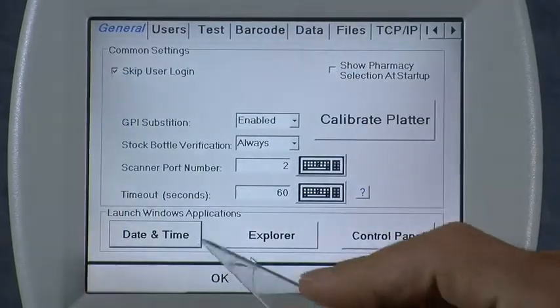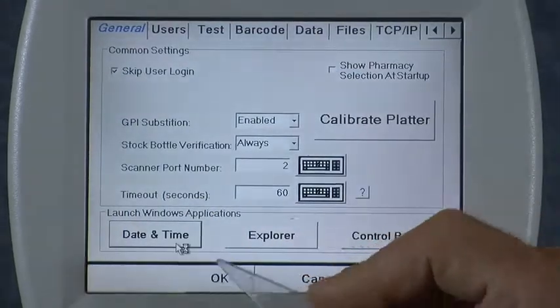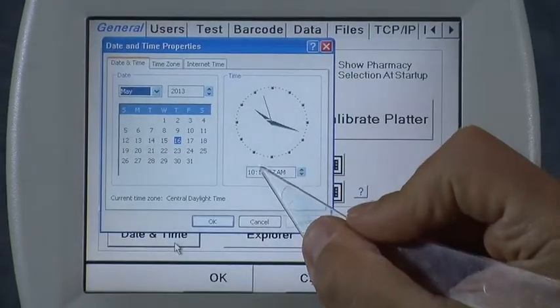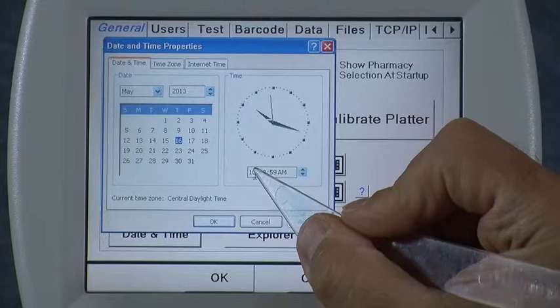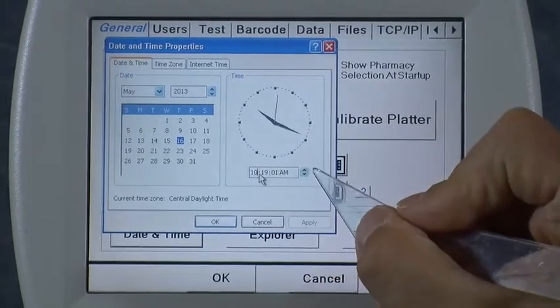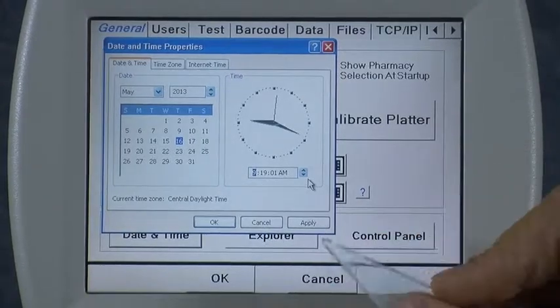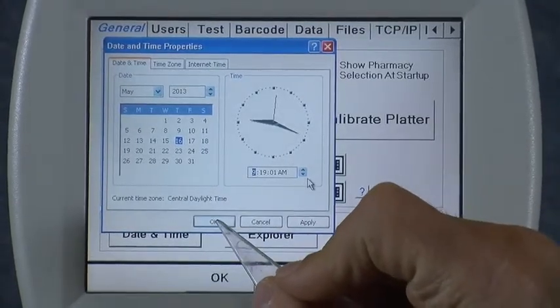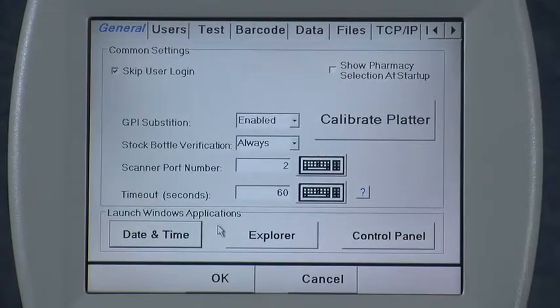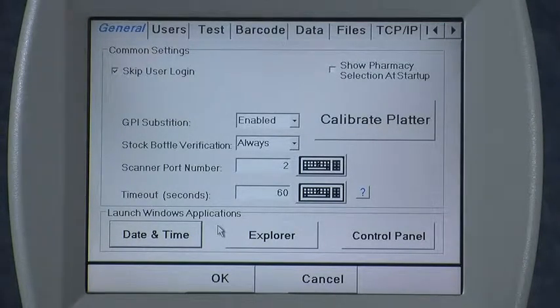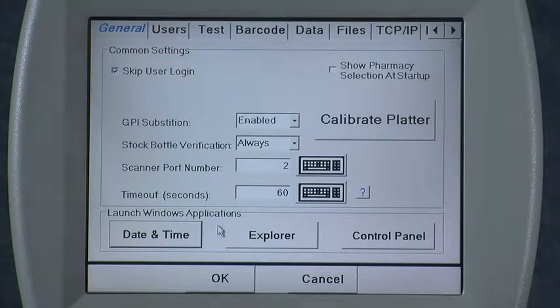You can set the time itself by clicking on the hours, minutes, or seconds, and then hitting the up and down arrows to change the time accordingly. Press OK once you get it to where you want it to be. All of your prescription data recorded every time you press the finish button will have accurate timestamps on all your prescriptions — fairly important if you want to have good data.